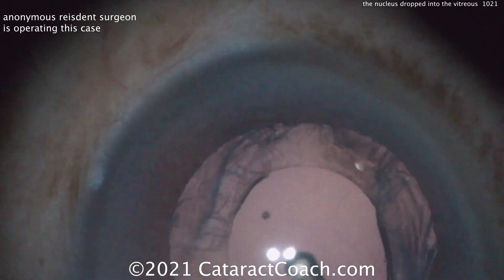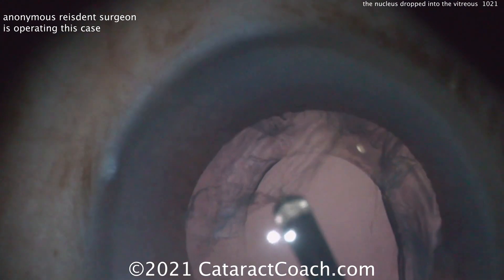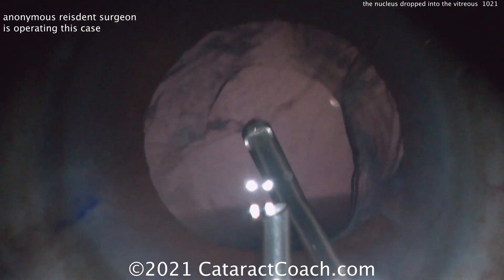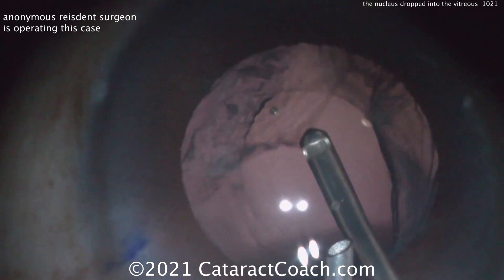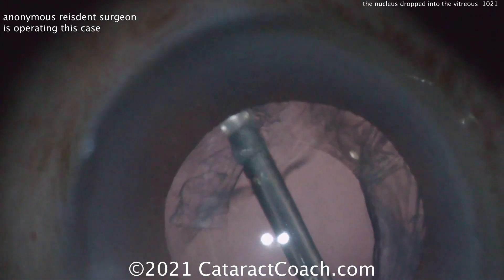Clean up the prolapsed vitreous. Use preservative-free triamcinolone here — it'll help you stain that vitreous to see how much is left. Be careful: don't put traction on the vitreous because that can cause a retinal break or detachment. You need to preserve as much capsule as possible so we can get a lens in the eye.